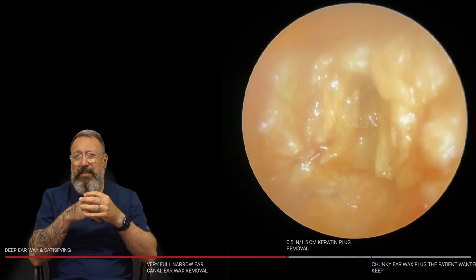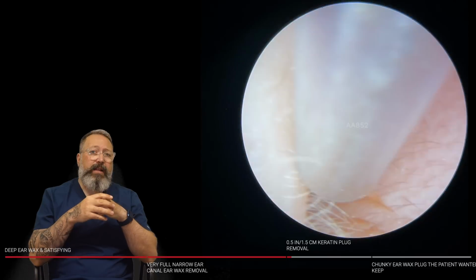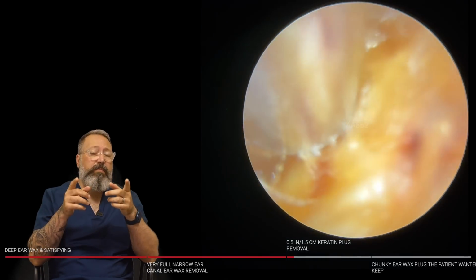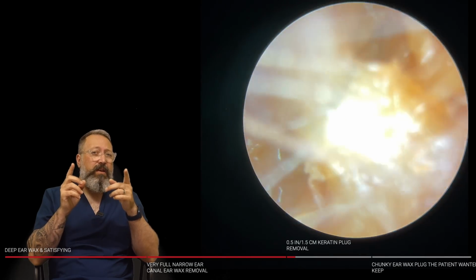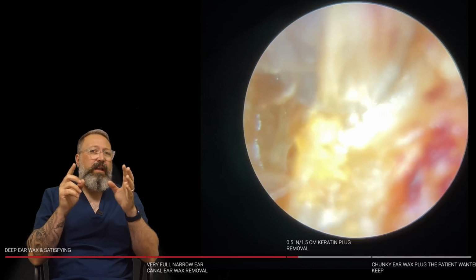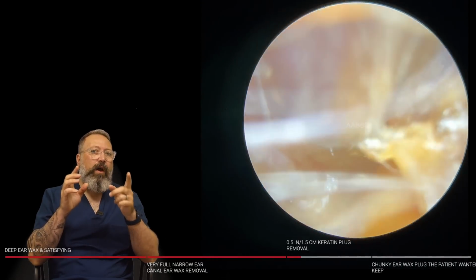Oh, when we talk about keratin, my goodness me, this poor gent. This guy came through and he's got a very, very thick keratin layer. Now this guy's a rugby player. He took a really bad knock to the ear probably about nearly 12 months ago, and has recently started having real hearing issues now. You'll see why in a second.